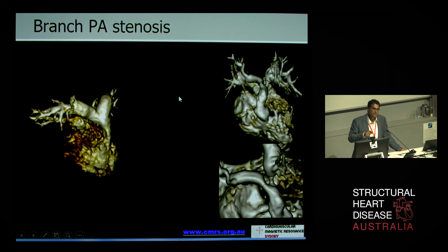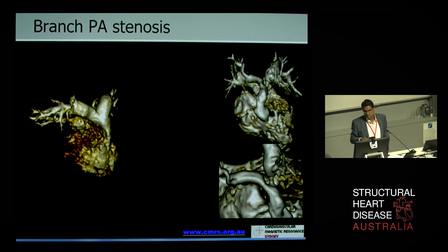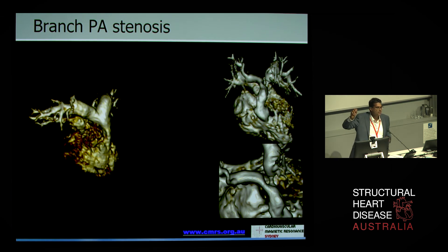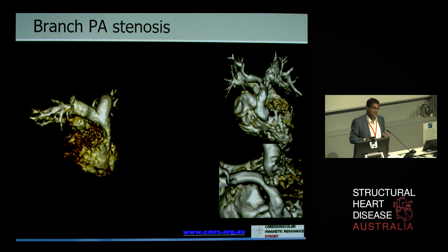MRI also adds value in looking distally into the branch pulmonary arteries. In the middle you see nice big branch pulmonary arteries that arborise really well, but on the right you see a really fixed focal stenosis at the origin of the right pulmonary artery. You would probably stent that too, because it just adds to the afterload on the ventricle — there's no point in fixing something at the valve level if you've got more stenosis distally. The ability to visualise that on MRI is really important.